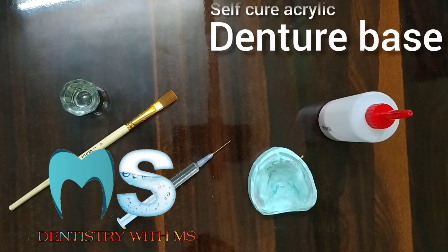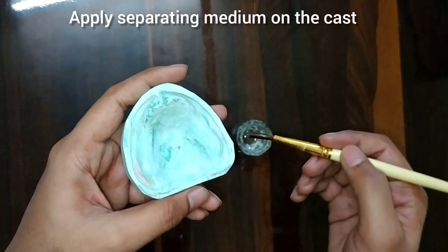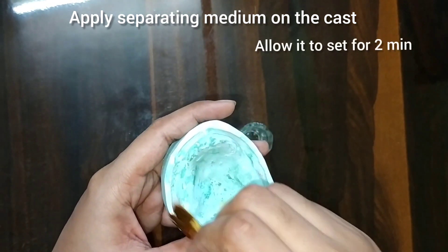Welcome back to the channel. This time we are going to make the self-cure acrylic denture base. First of all, we will apply the separating medium on the cast and allow it to set for two minutes.